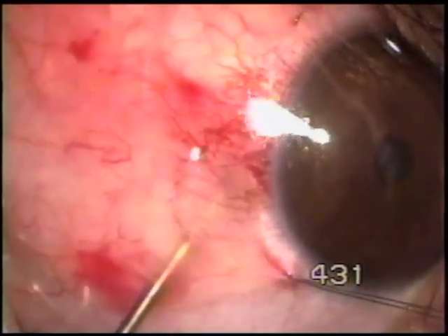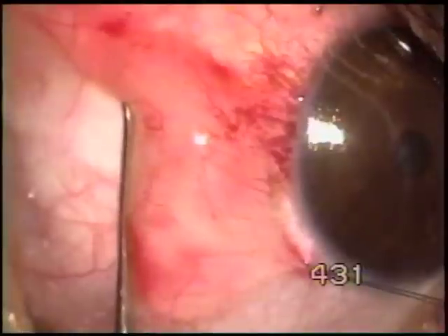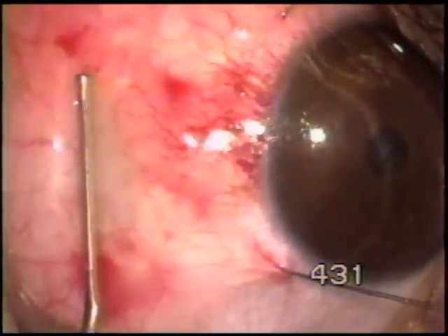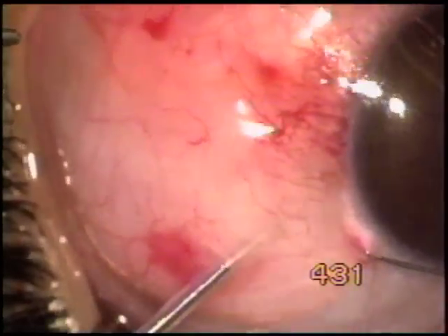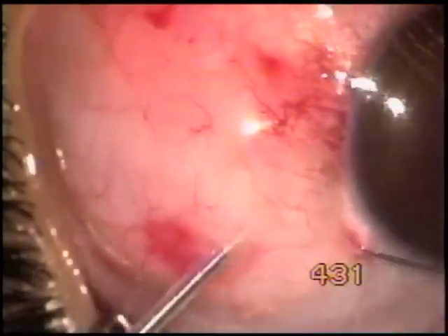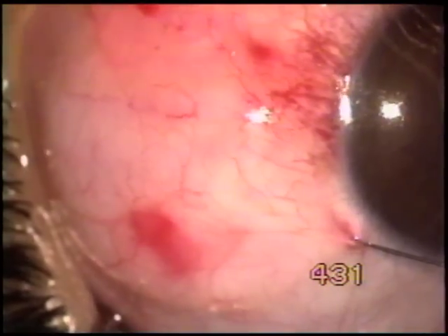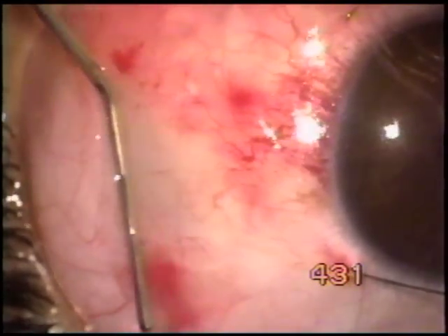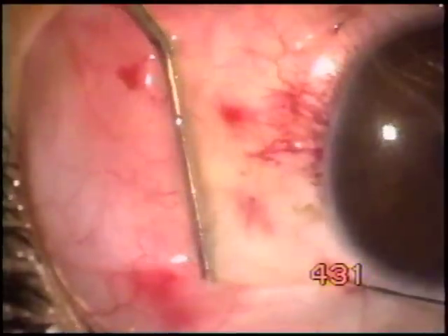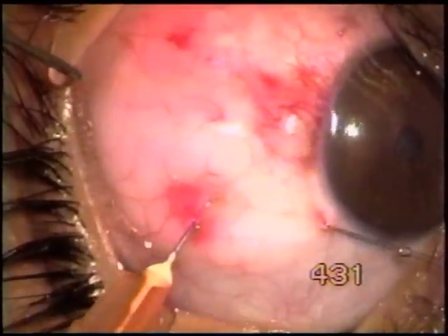Injecting saline to separate the tissues. Now activation of the tip is kept for longer, and the activated tip is moved side to side — there is still plenty of tissue to be treated.